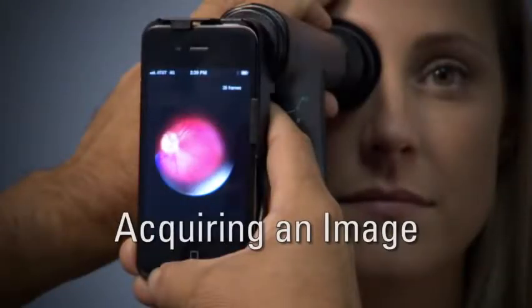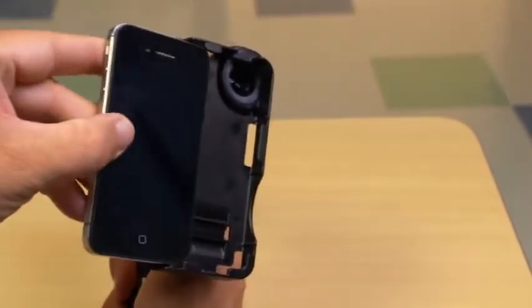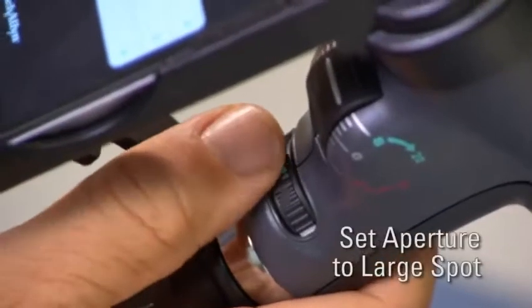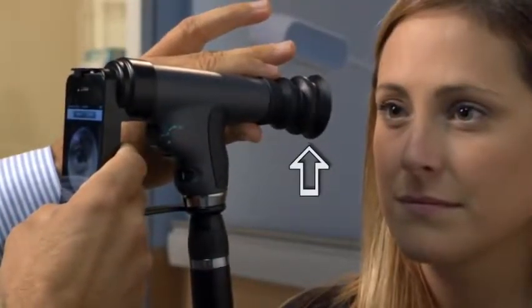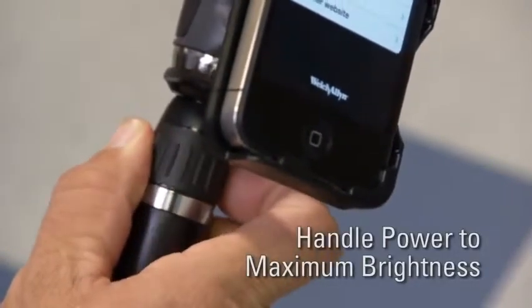The following procedures are intended to guide you as you learn to use the iExaminer. First, attach your iPhone to the PanOptic according to assembly instructions. Set the focus wheel on 0. Set aperture size on the large spot. Ensure the eye cup is secured firmly on the patient's side of the scope. Turn handle power to maximum brightness.